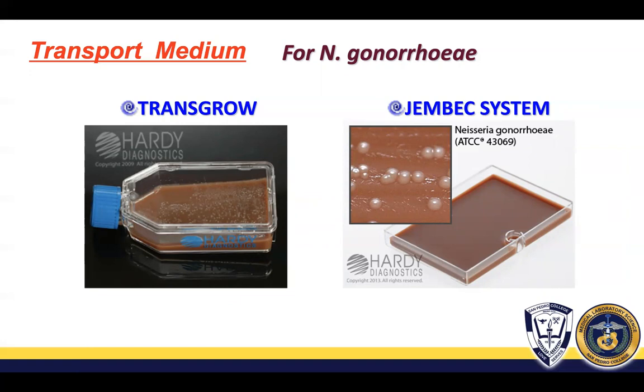Okay. So remember, if this one is used, the bottle must always be held up in the upright position, especially when the cap is off. So when you have opened the setup, when you remove the cap, this should not be lying down like this. Okay, the bottle should be straight up. So it looks quite familiar, right? So we use this bottle for parasitology laboratory. Yeah, we use that to contain the NSS, but actually this is the main purpose for those bottles, culture bottles. Okay, so they should be held upright.